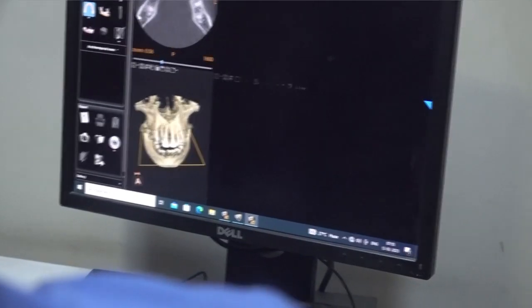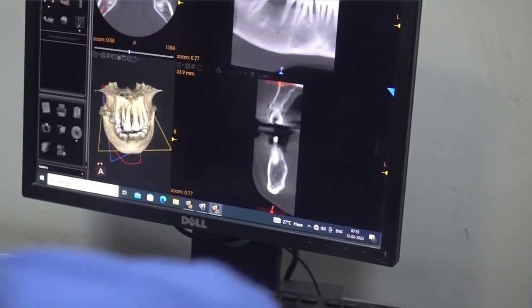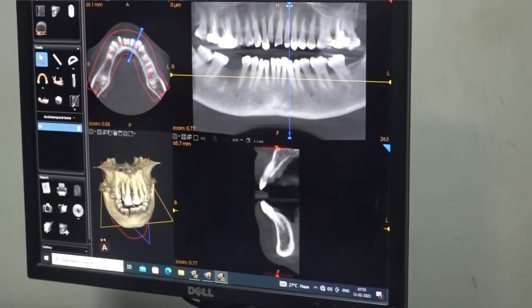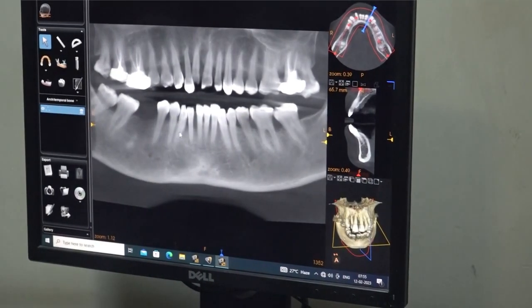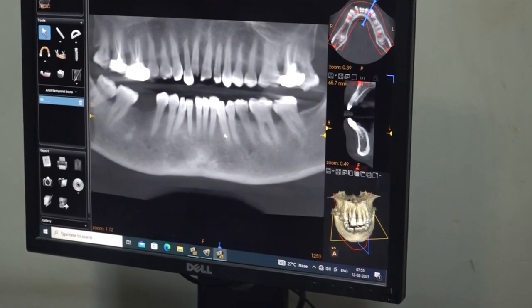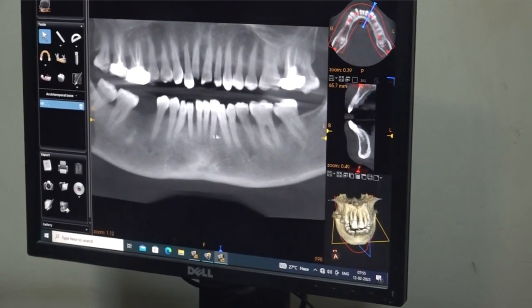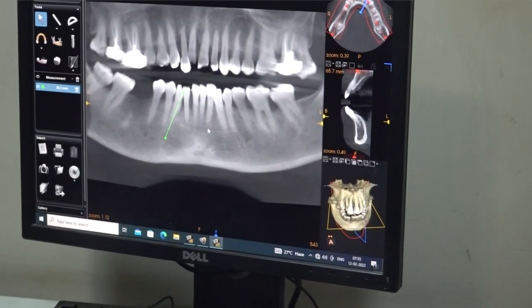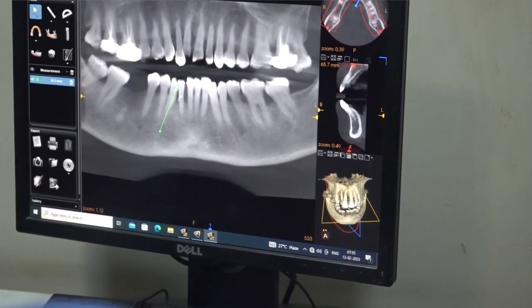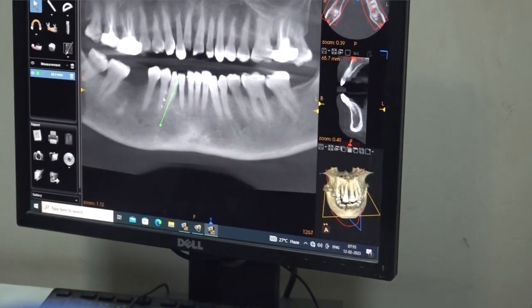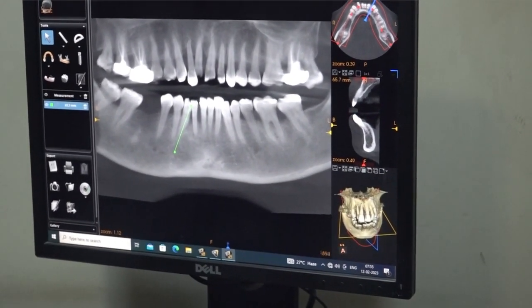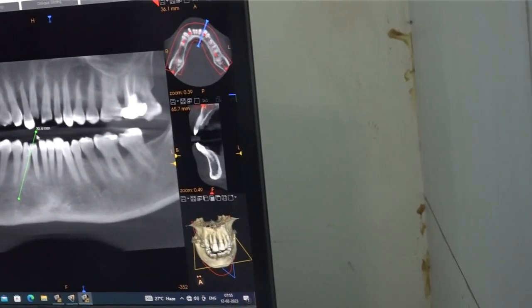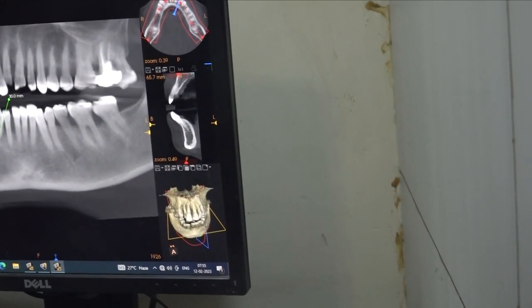We are going to draw the arch form for the lower anteriors. The challenge here is that the canine is closer to the premolar. If you place the implant along the long axis of the tooth, you may end up too close to the premolar. Not only that, the abutment will angulate distally, and you cannot bend it because of the premolar.